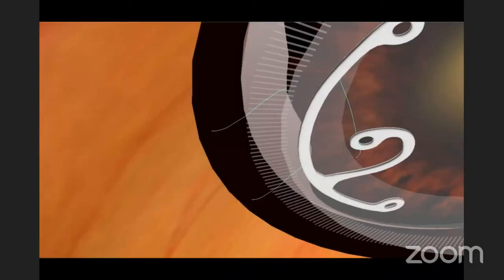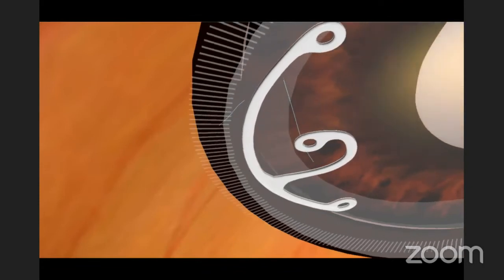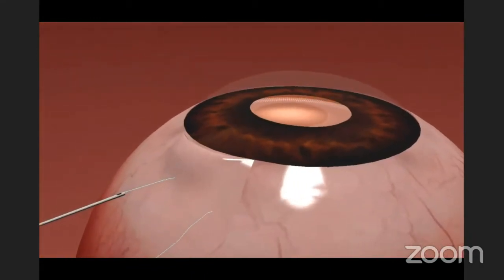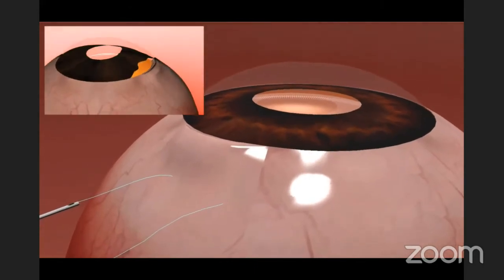The segment CTR supports the subluxated capsular bag, and the iris is approximated to its root by the suture, that is, iris repair is done. All this by a single loop of suture, so you can kill both the defects at one go.